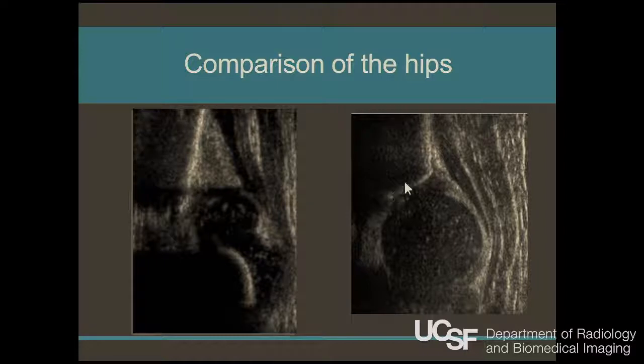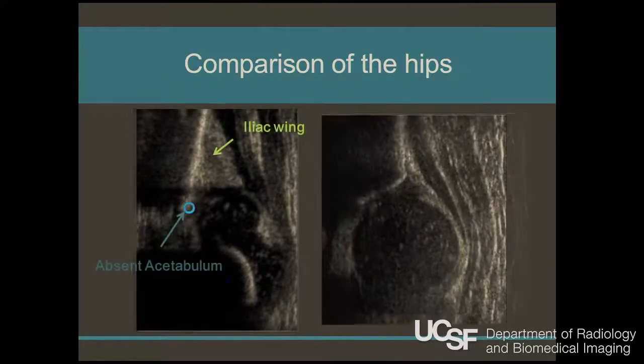You can see here. The only time I've ever seen someone make it look normal when it was abnormal was that there was some artifact down here, and they actually started measuring something that wasn't even the acetabulum, but it was one of these ones where it was so abnormal that someone didn't even quite get that it was abnormal, and they started measuring it as normal.